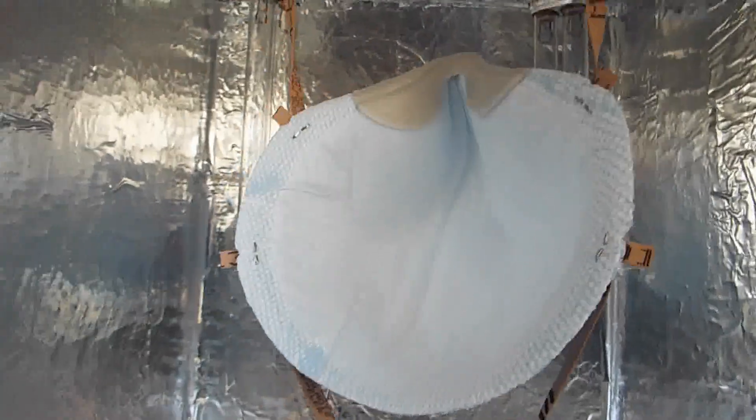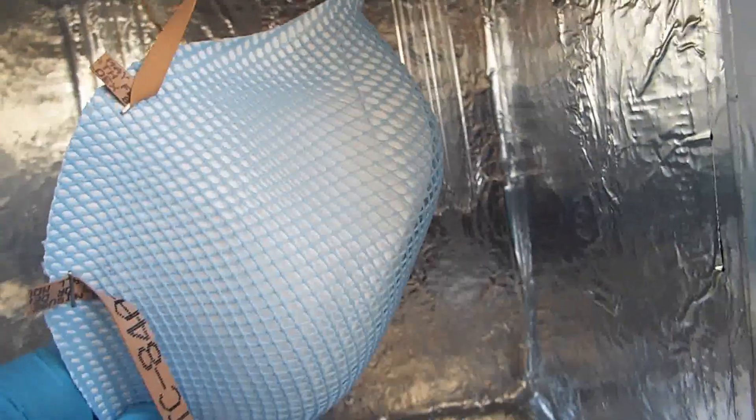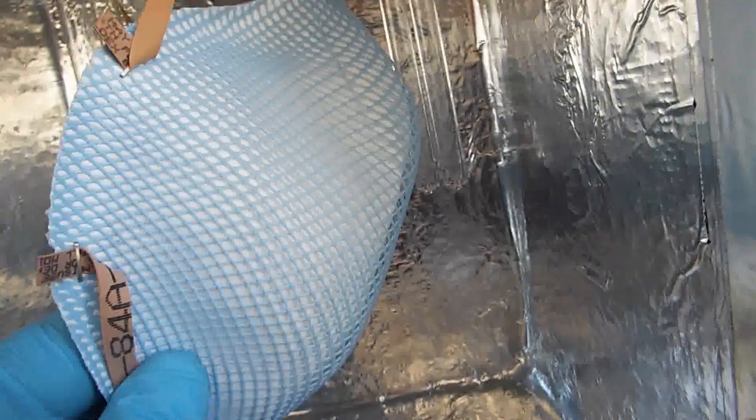This minimizes shadowing effects. So you can see, if the mask were just sitting here stationary, you see that net on the front of it.